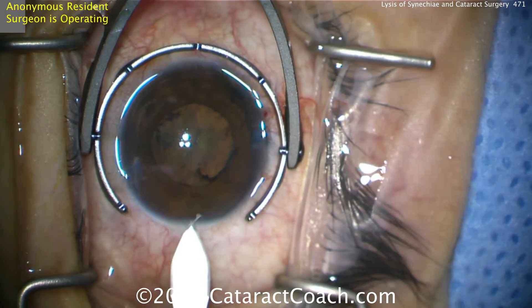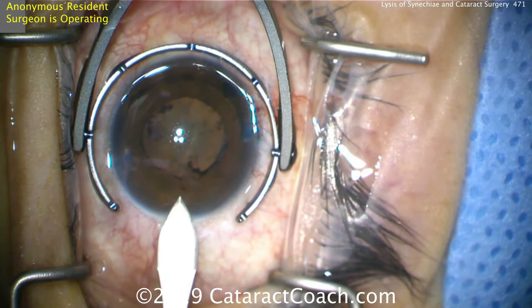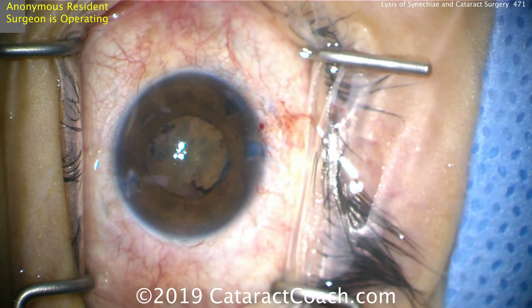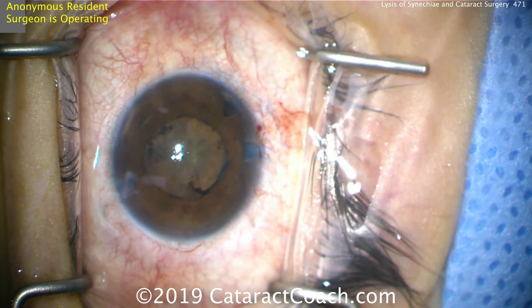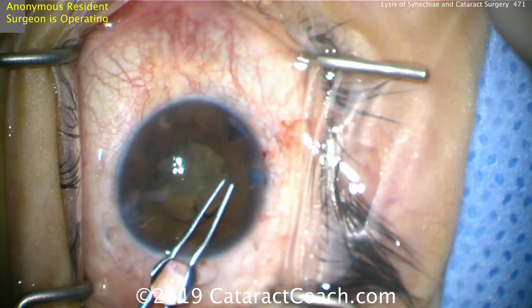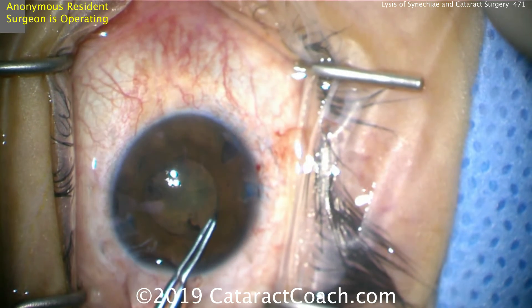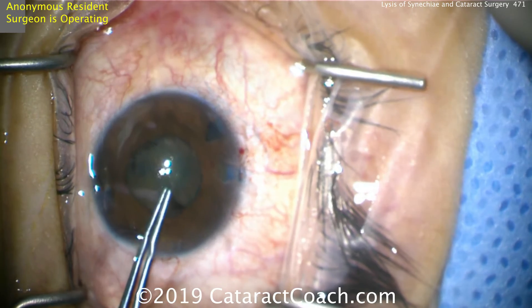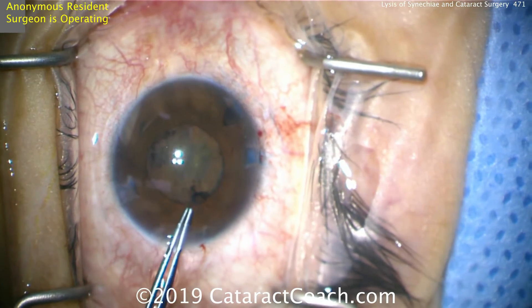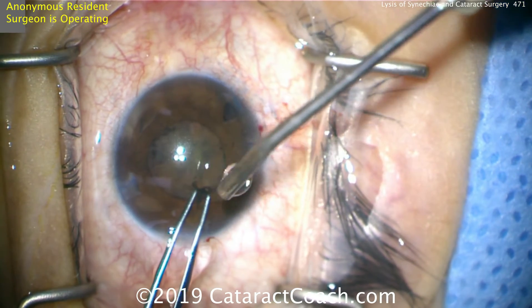Here's the main incision. The resident is doing a great job — that looks like a very good incision entering the anterior chamber, using the triplanar technique we've talked about on CataractCoach. Now before we do the capsulorrhexis, let's try to peel away some of the fibrotic tissue or membrane covering part of the pupil. You can grab onto it and pull it to try to remove it — this is helpful because it's also preventing the pupil from expanding more.